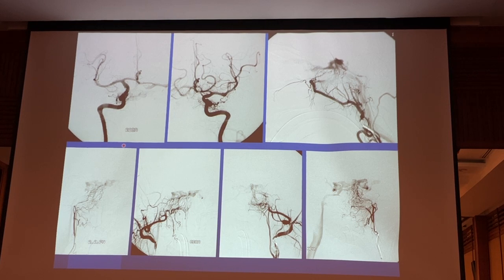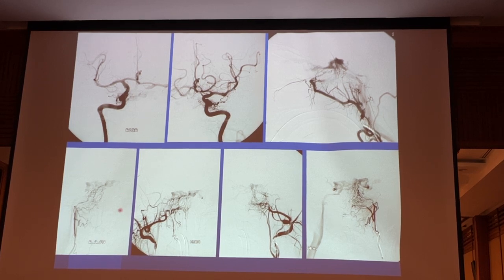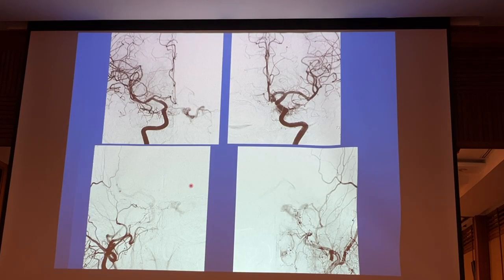You have to recognize, often, most of these, as I showed you, 30-some cases of posterior superior compartment, we had only one case of bilateral cavernous sinus shunt. Even though you may have bilateral supply, usually the shunt is on one side. This is one of those cases which has bilateral supply, bilateral venous outflow to the ophthalmic veins.